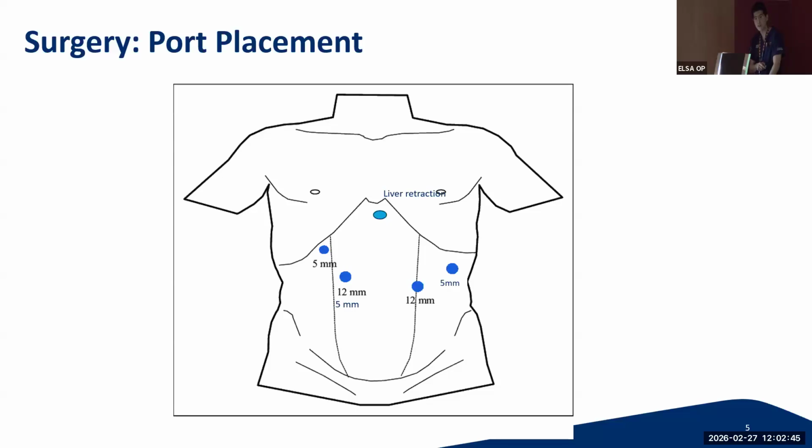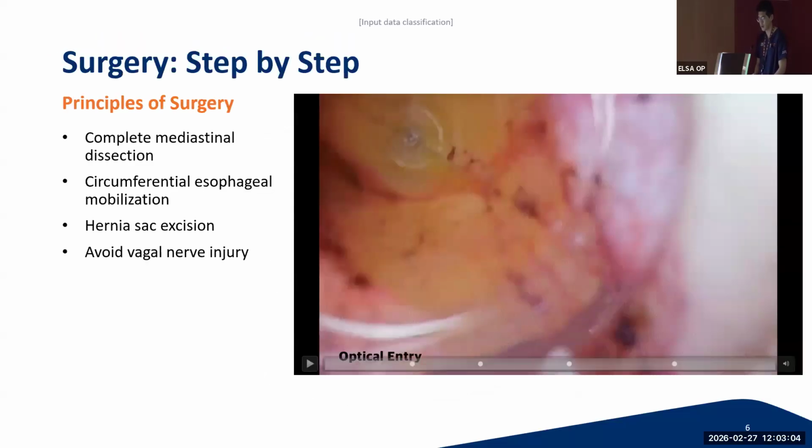Sometimes I use a trocar because that allows me to introduce my sutures more easily. So it's usually 2 working ports and 1 assistant port, as well as a liver retractor. I usually have the patient in a supine position with a footboard and the patient in 30-degree head up position. So it's important to strap down the patient so that they don't slide off the bed.